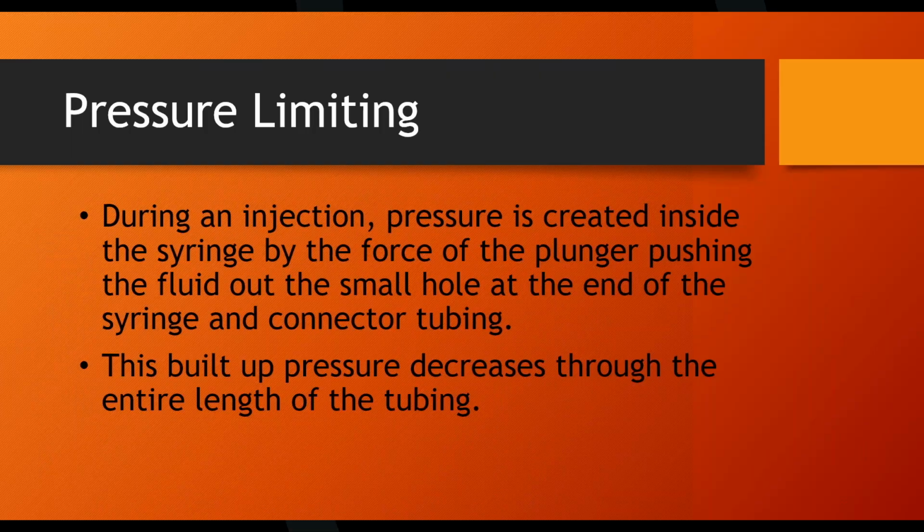Angio, did I say angio? CT and MR injectors will go to 300 psi. I'll talk about why that is in a minute. Angio injectors will go up to 1,000 or 1,200 psi. 1,000 pounds of pressure in a syringe like that. Of course, this is not going into the patient.